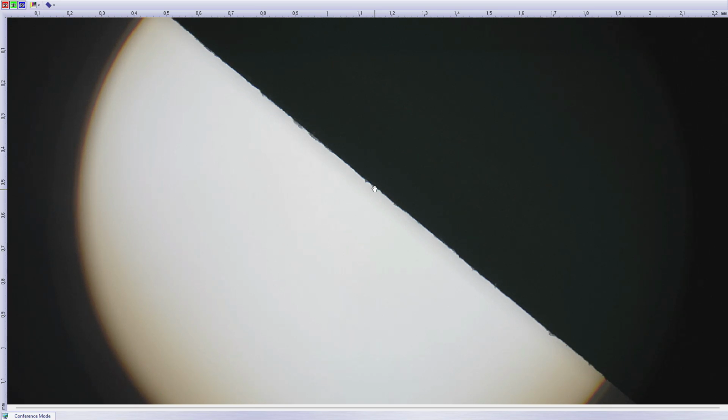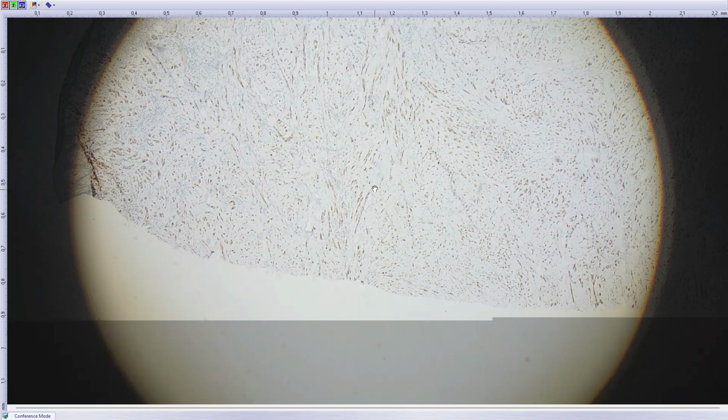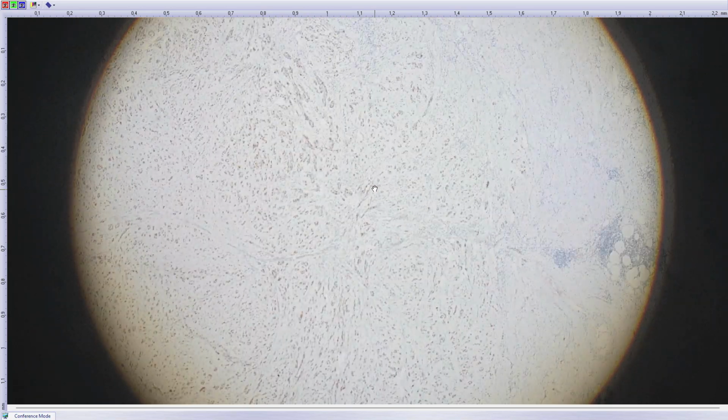This S100 was the same. I've probably not got the right marker, the right slide. So tyrosinase was negative. HMB45 was negative. PRAME was positive in the tumor cells. PRAME is a very non-specific marker for melanoma, but when it's not there, I'm not saying forget melanoma, but it makes melanoma very unlikely.